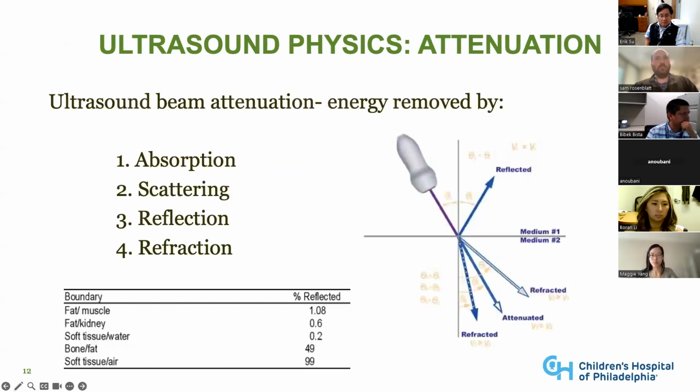One other thing that's really important to talk about is attenuation of that ultrasound beam. Remember, we're sending out an ultrasound wave from those crystals that have piezoelectric properties, sending out that ultrasound wave that goes through tissues, right? But recognize that not all of that wave comes back, and that's how we can discern what is going on and how we get different hyperechoic, anechoic, isoechoic kind of structures, right?